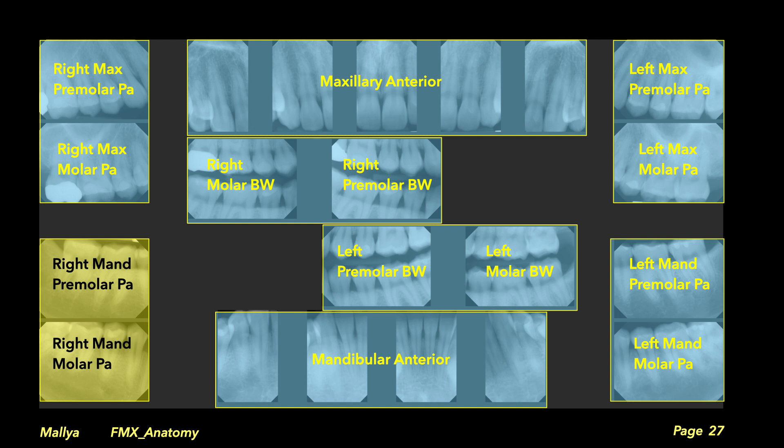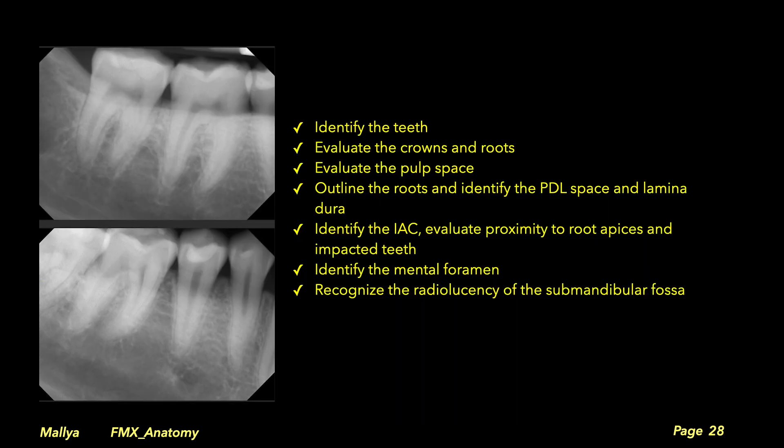We move on to the right mandibular posterior region, following the same systematic sequence: identify the teeth; evaluate the crowns and roots; evaluate the pulp space; outline the roots and identify the periodontal ligament space and laminar dura; identify the inferior alveolar canal and assess its proximity to the root apices; identify the mental foramen; and finally, recognize the radiolucency of the submandibular fossa.